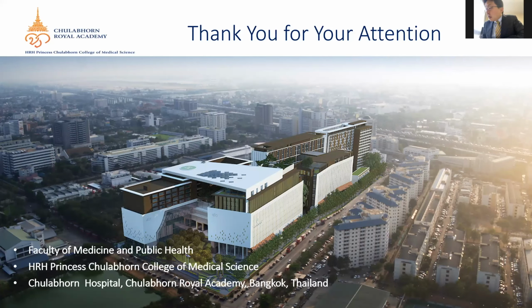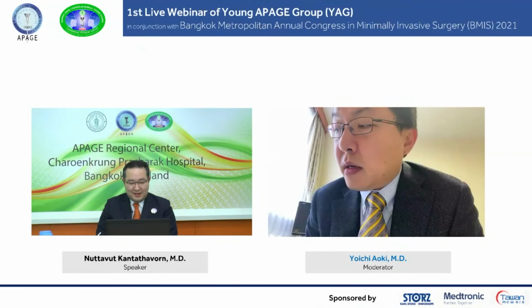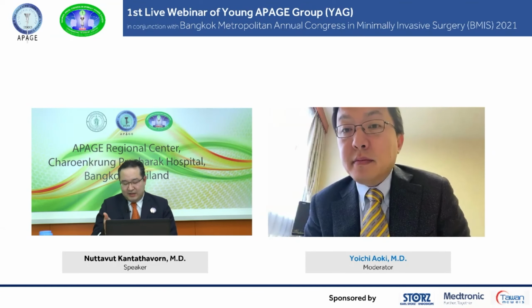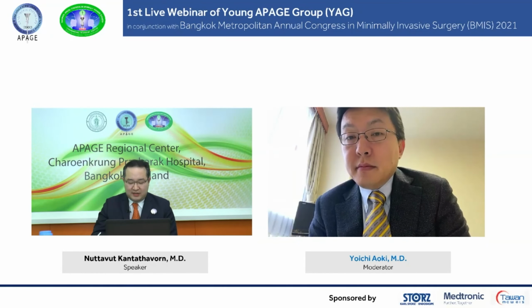Thank you very much. So I got a question about ovarian cancer. How to inject ICG for ovarian cancer? I inject at the cervix as we perform for uterine and cervical cancer. There are some studies reporting injection into the infundibulum, but I think in this case, after I inject at the cervix, we can see many lymph nodes show up as we presented. So I think this is adequate mapping from the cervix injection alone.